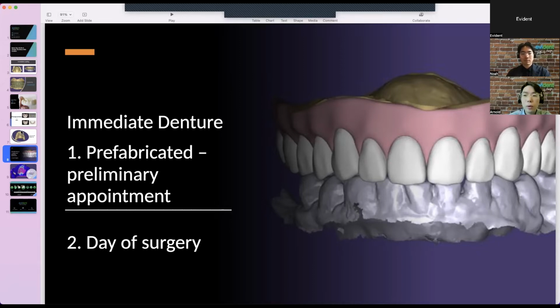So for example, for upper, we have good reference points such as hard palatals as a landmark to superimpose it for the bite alignment, right? However, for lower, it's just hiccup. Unlike upper landmarks with hard palatals, lower has the big limitations on providing enough landmarks. So in this case, we can use bone screws, right?